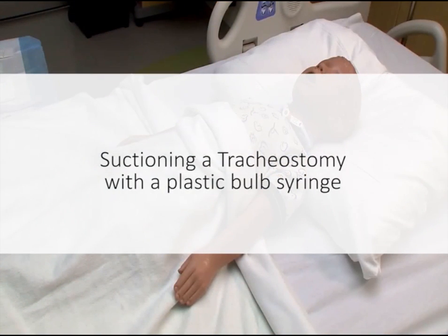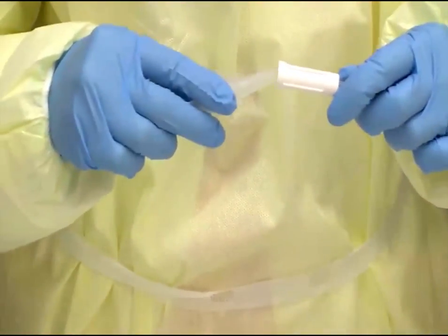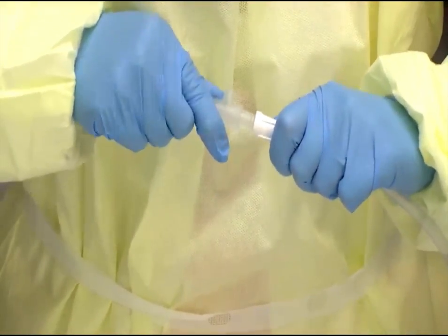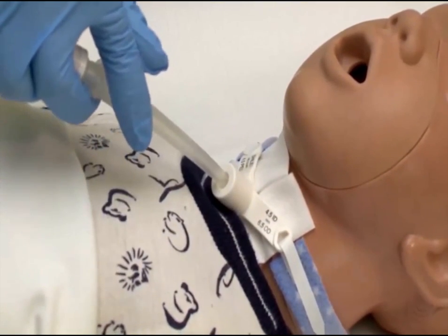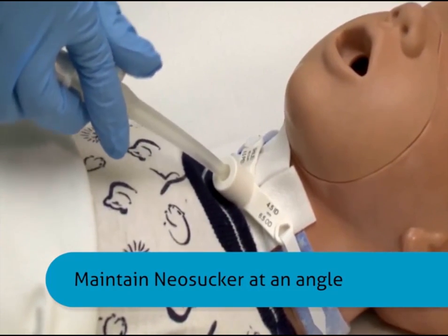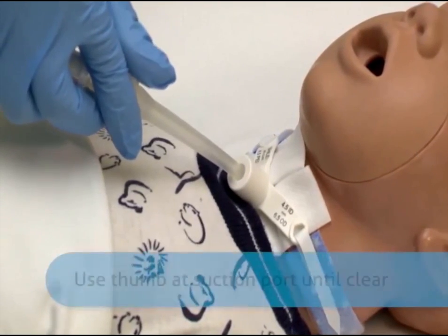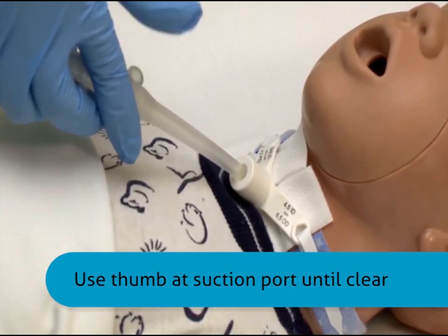Suctioning a tracheostomy tube with a plastic bulb syringe. Note: do not rely on bulb suctioning totally for trach care. Deep suctioning should be done when the patient first wakes up and then as needed. Begin by washing your hands. Connect the neosucker to the suction apparatus. Place the tip of the bulb syringe at the tracheostomy tube opening. Do not obstruct the entire airway, maintaining the neosucker at an angle. Place your thumb over the suction port and suction until secretions are cleared.